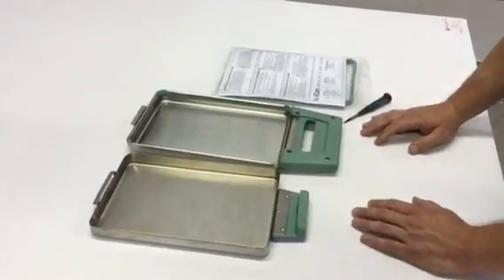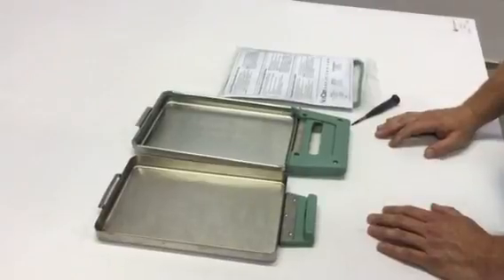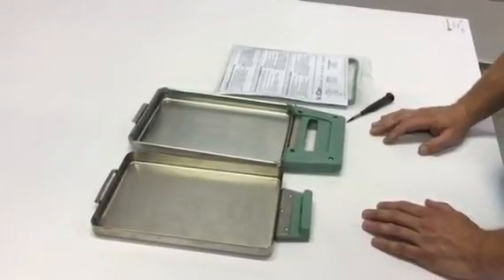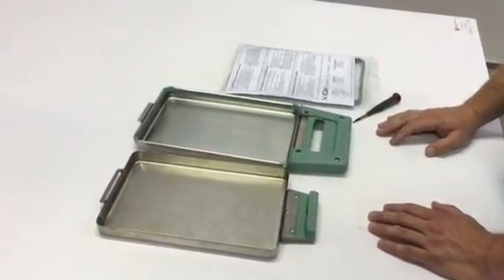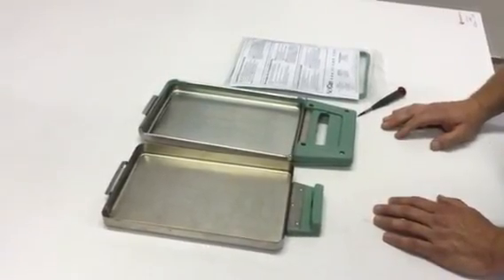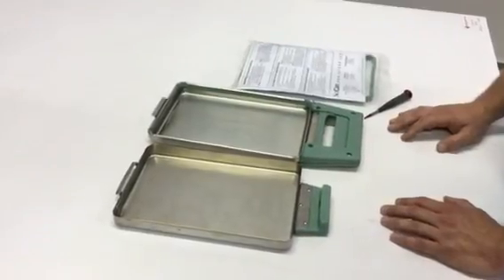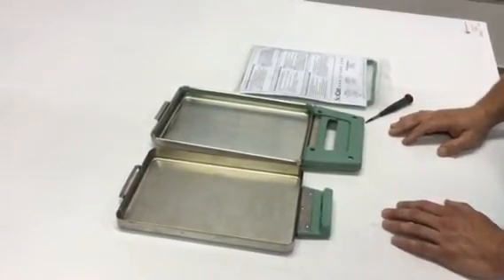My name is Andrew from Sterilizer Autoclave Solutions here in our facility in Charlotte, North Carolina. Right now we are going to go over some quick preventative maintenance on replacement of a STATUM 2000 cassette seal. The cassette seal should be replaced every 500 cycles and or six months.